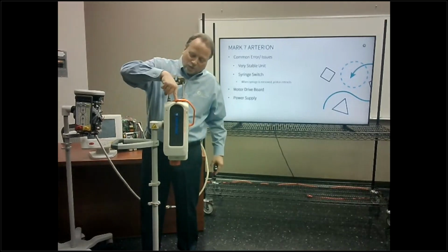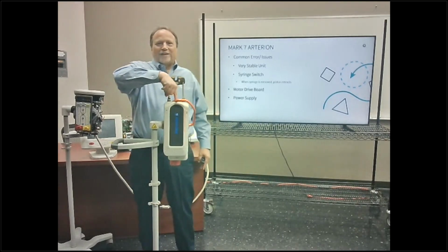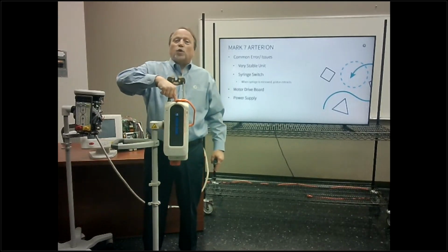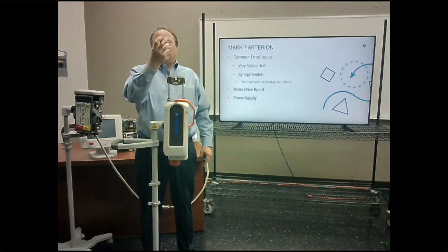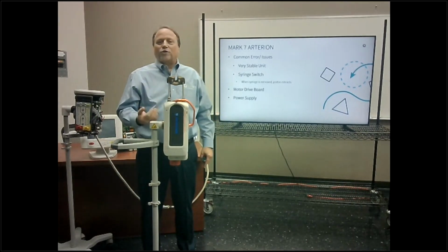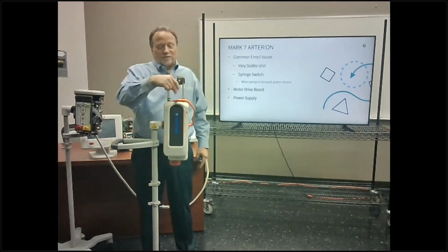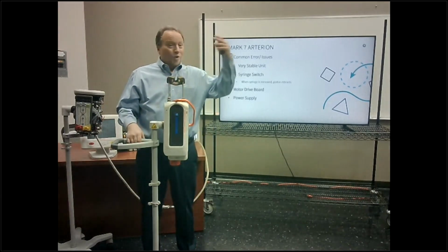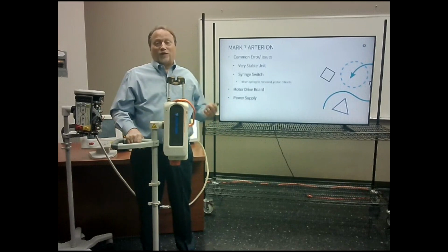Well, there's the pin right in here. It's a syringe sensor. And the syringe goes in and pushes down on that pin. When they pull the syringe out, the pin pops up and the piston retracts to allow you to put a new syringe in. Well, what happens is if they have a leak in that syringe that's been sitting there all weekend long, the first case will go just fine.